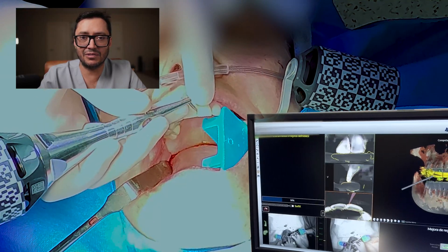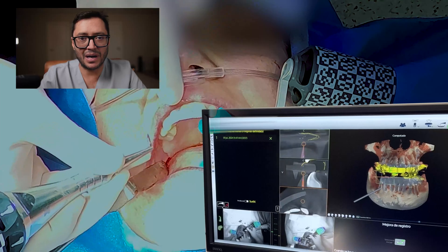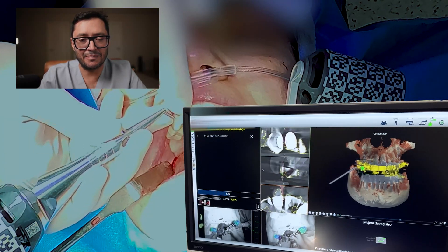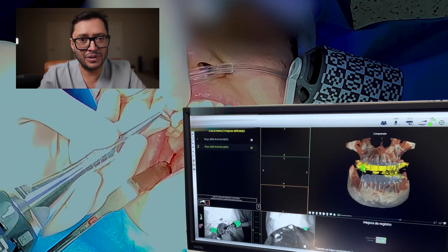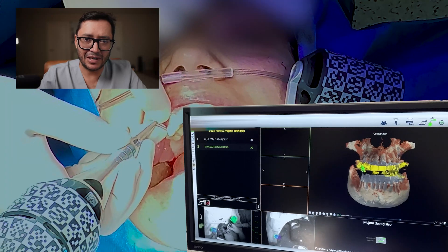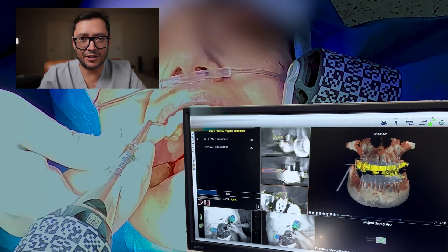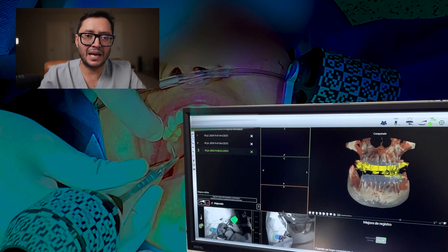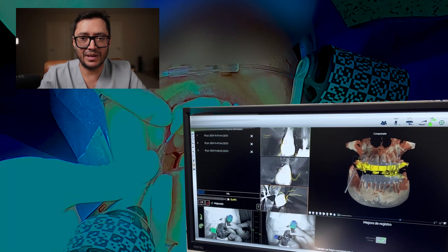With these steps, we take three to four measurements and check them on the patient, verifying that we have the same point on the screen. Afterwards, we improve the system even more by doing a slight painting over the tools and then checking them on the software. With this, we can be completely sure that what we are pointing to on our navigator is accurate. I may go to a cusp or a specific landmark I find in the oral cavity and check it correlates with the imaging.